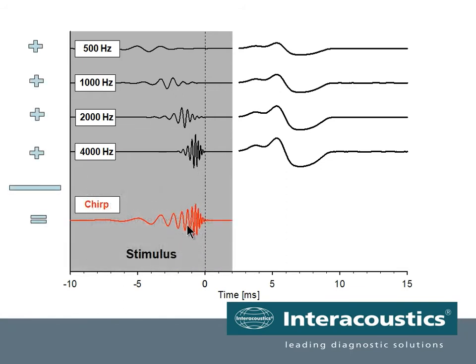And it looks like that. So this is the sum of such parts of the stimulus. These are the associated response components, and if we add those together, we will see what we get down here.